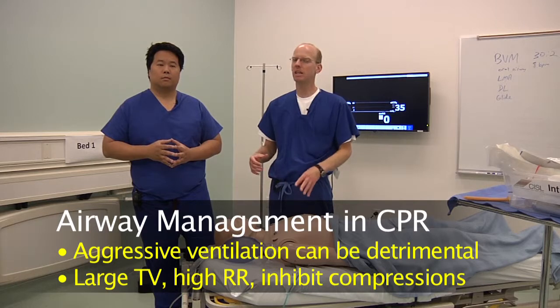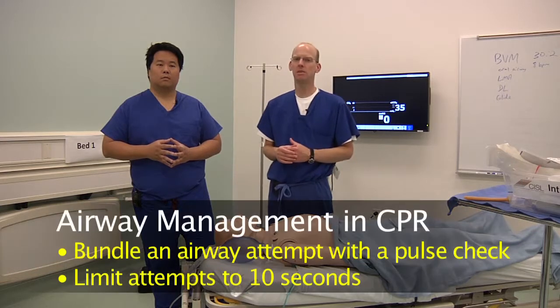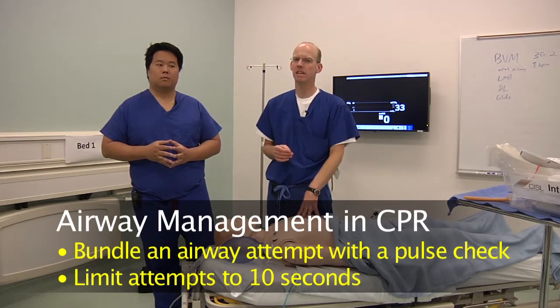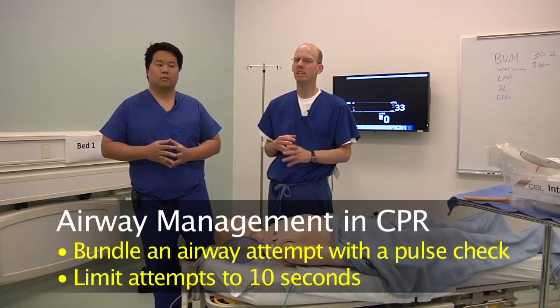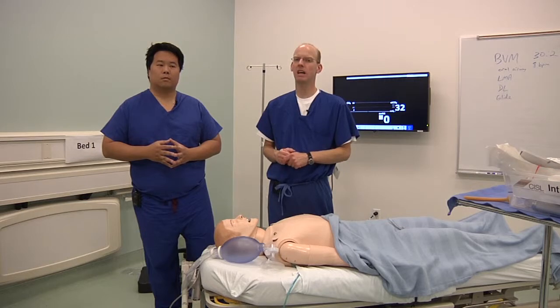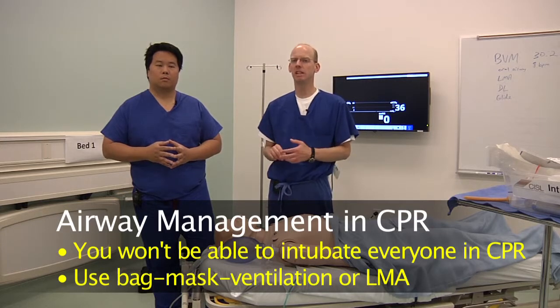We do have some techniques that we can quickly show you on how you can improve things. You can try and bundle a direct laryngoscopy with a pulse check, but like I said, we want anything that's not a compressing event to be less than 10 seconds. It's actually pretty hard to intubate someone in less than 10 seconds. And then they got to start. They can't wait for you. They got to start compressions again as soon as they can. So get away from this idea that you're going to intubate everyone in an arrest. Just figure out how to effectively ventilate the patient.